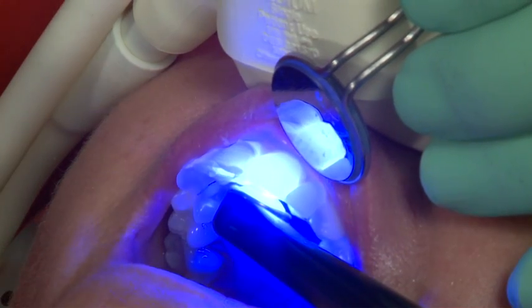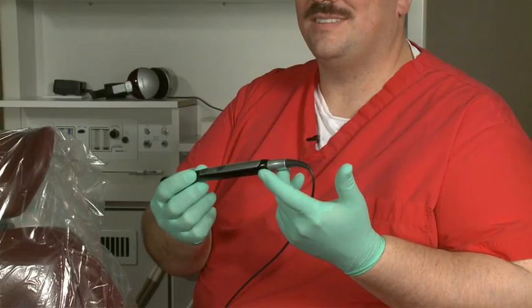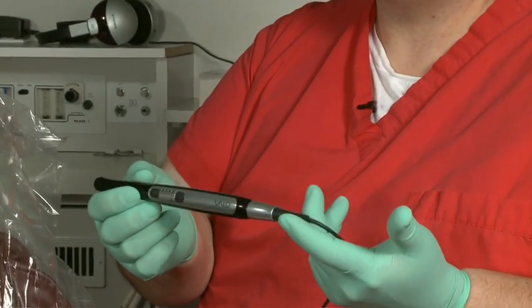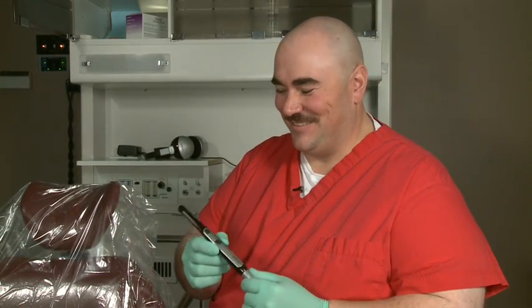The VALO is very ergonomic both in the mouth and for the user. It's lightweight. It's small. It's not intimidating. The patients like it. My assistants love it. I love VALO — I don't like it, I love the VALO light.